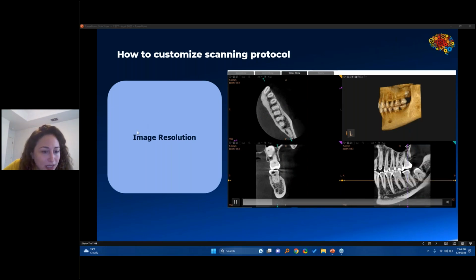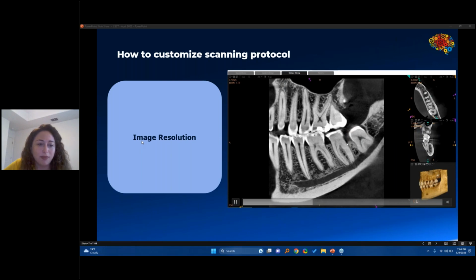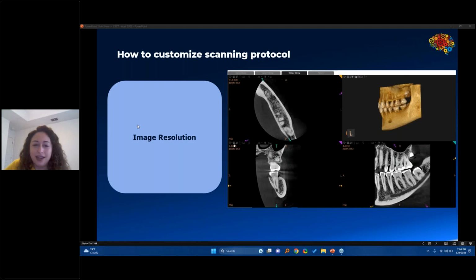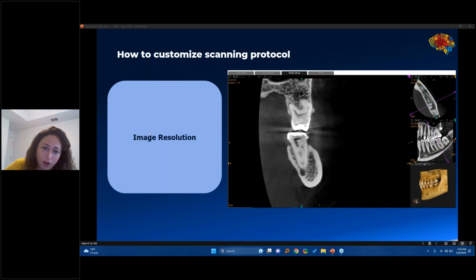If CBCT scans are so safe and offer better diagnostic capabilities, why do most dental insurance companies not cover or pay for them? Why hasn't the ADA addressed this issue with these companies? So I think this is more of a political reason rather than just CBCT scans not being safe, especially when it comes to insurance companies covering them or not, or the ADA addressing it or not.